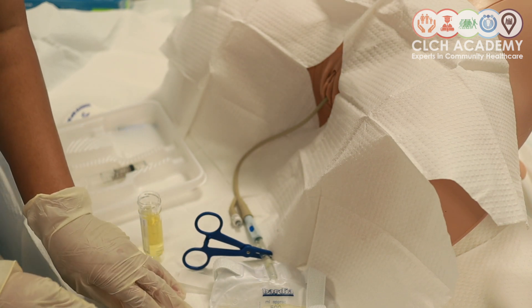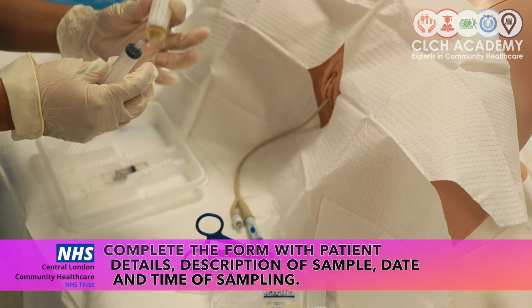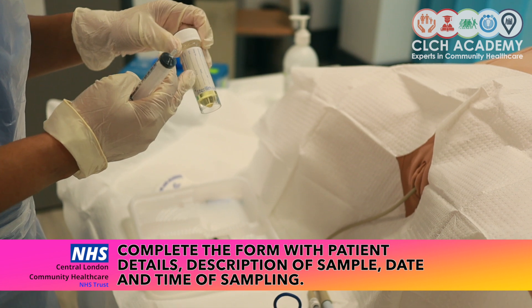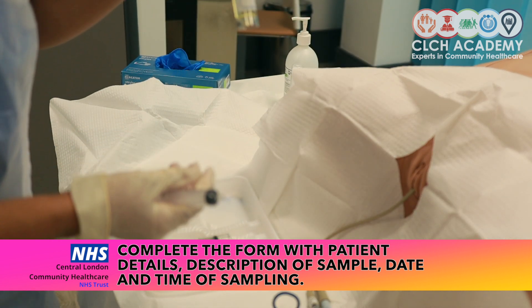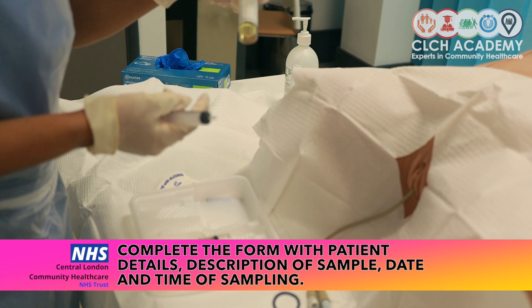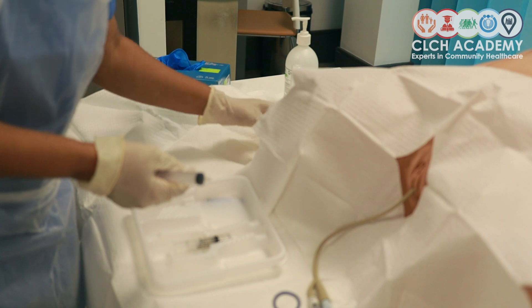You only need about 10 mils for your urine sample. Then you're going to label it appropriately with the patient's surname, name, date of birth, and all the relevant details. You would also note that this is a catheter specimen, along with the date and time that the specimen was collected.